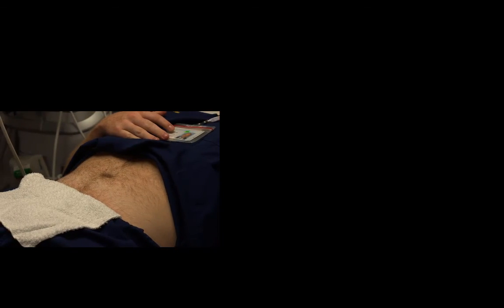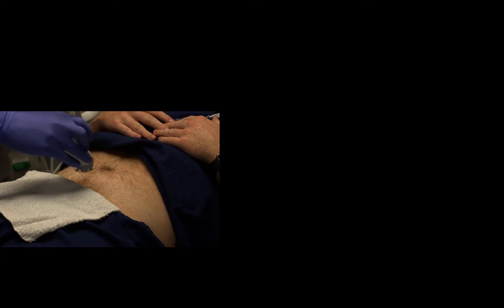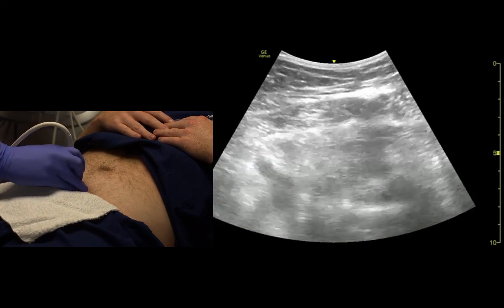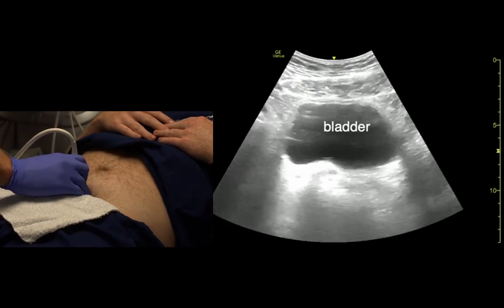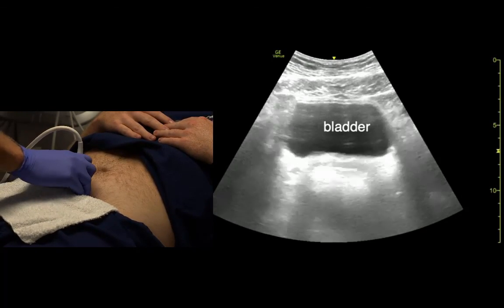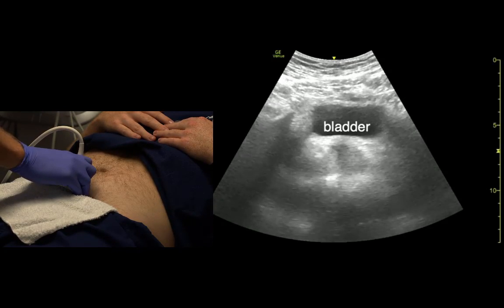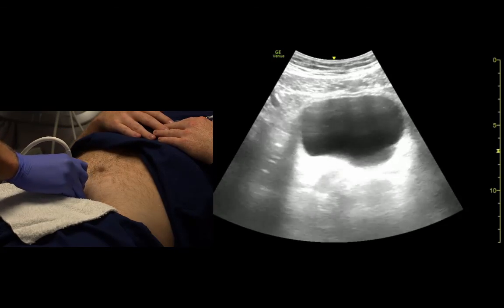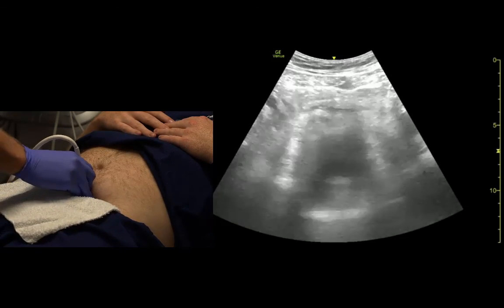Just noting the difference of the bladder in the male versus the female. Again, we're looking for the bladder just above the pubic symphysis. Take note that the bladder is not a circle, and in the male we can see there's prostate sitting back there. As we fan up, we shouldn't see really much else.